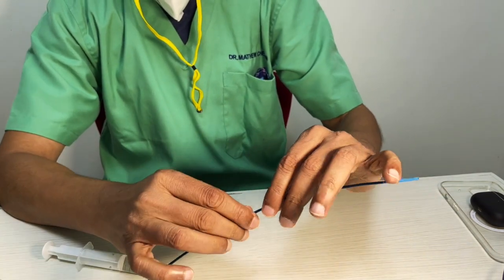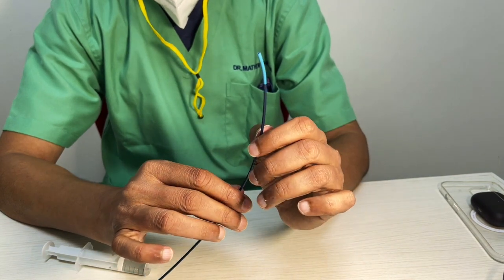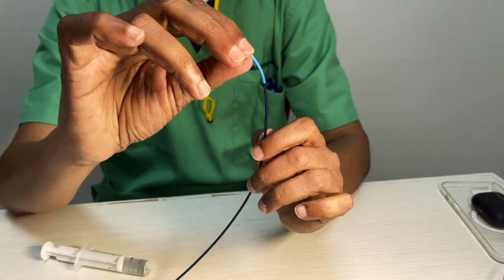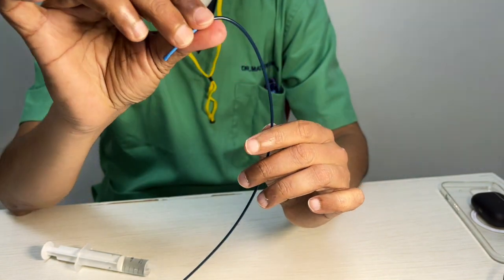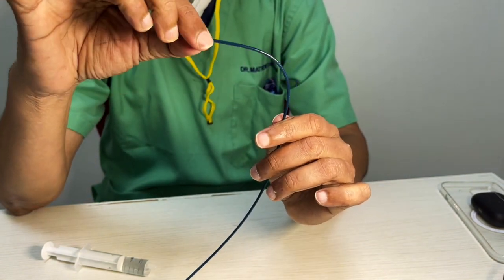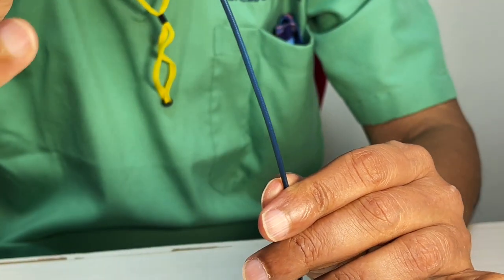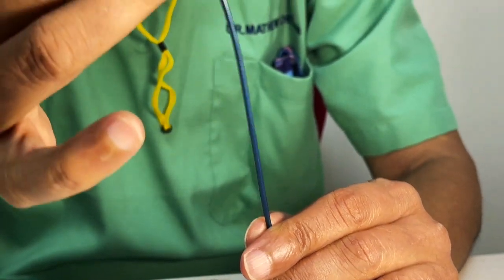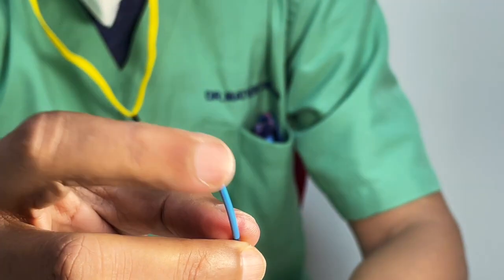The second thing is, you can technically call it just two transition zones. This is slightly soft. After that it is fully braided. And you know, the braiding runs through and through. You can actually see the braid. It is a helical braid. And here the problem is that it's a very stiff catheter. So if it goes into a bend in the internal carotid, this tip will dissect the vessel.